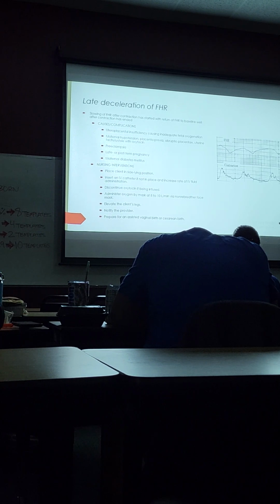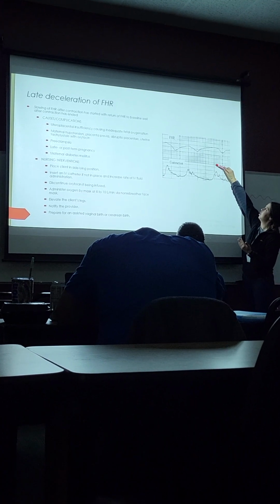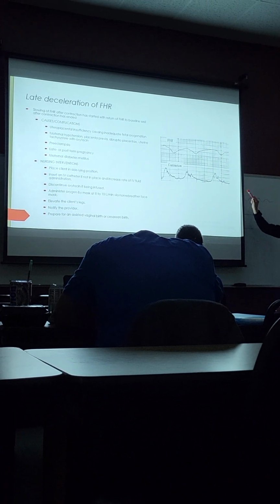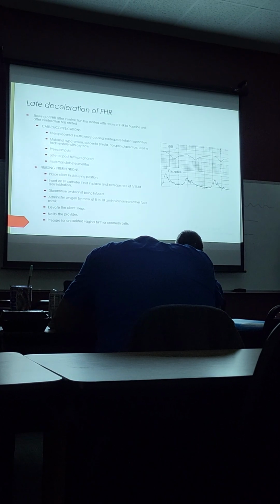If I'm looking at this one, and obviously I'm drawing this imaginary line, when is that decel happening? At the beginning of my contraction or after my contraction? After. So that would be your late deceleration. Okay? Does that make sense? Yes. So if our patient is experiencing late decelerations, remember the acronym LION.